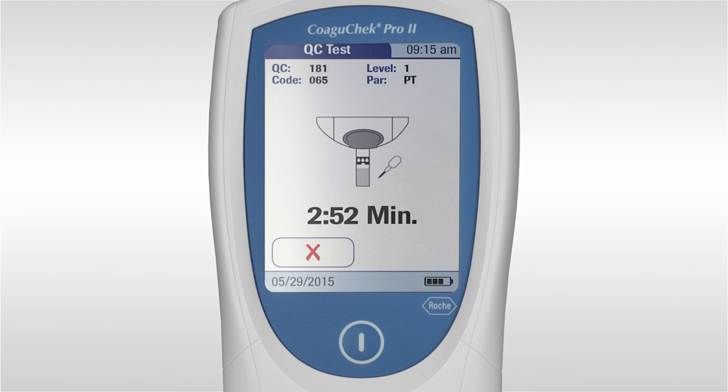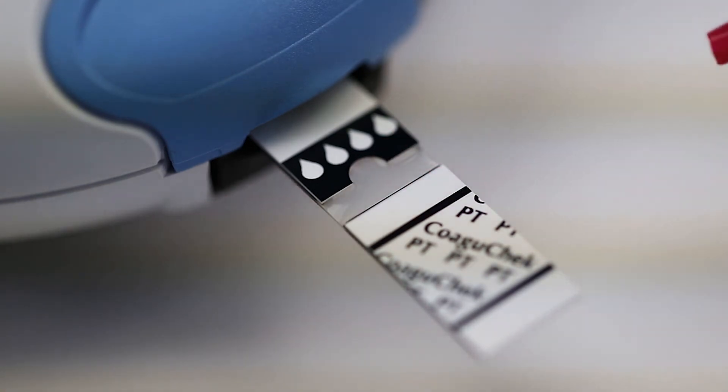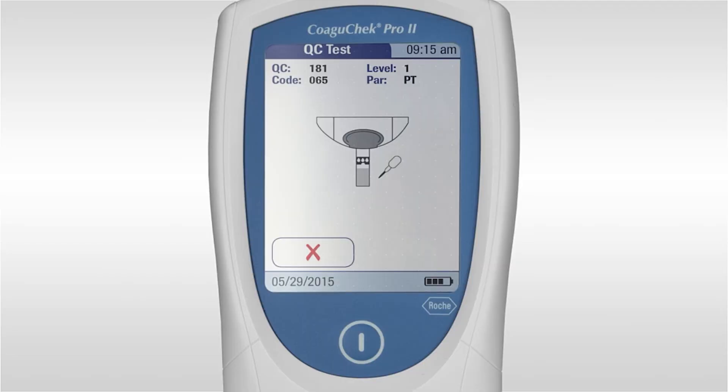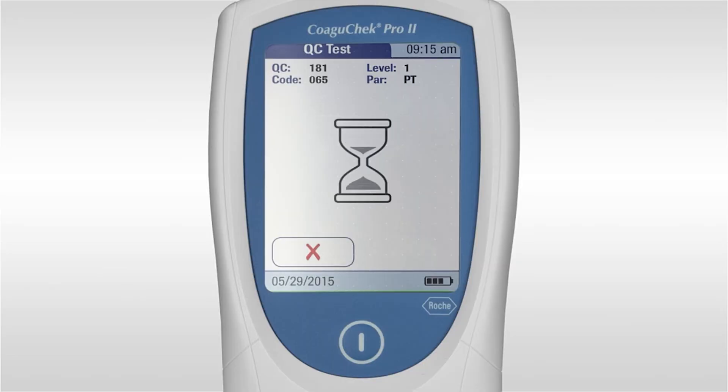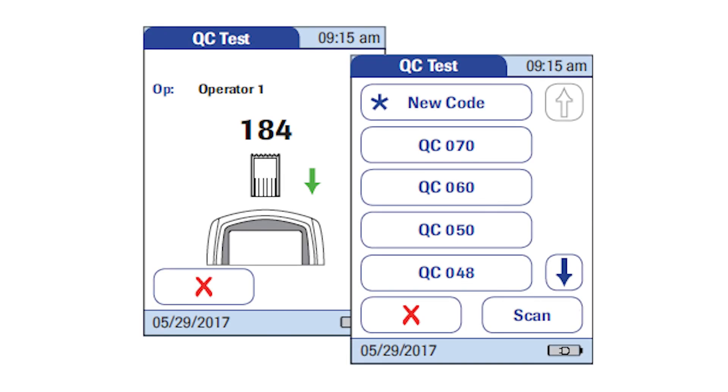You must apply the sample within 3 minutes. Apply the sample to the top of the clear testing area of the strip. The pipette symbol will disappear when sufficient sample has been applied. When the test has finished, the result will appear on the screen and will automatically be saved to the memory. Press new code and insert the code chip into the code chip slot until you feel it click into place. You will now be asked to select which level of quality control you would like to run. Select the correct level by looking at the label on the quality control ampule.